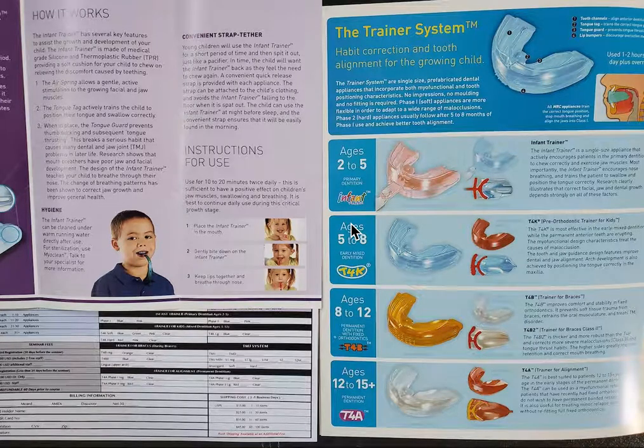And it was StraightSmile Solutions, and today we're going to be talking about Myobrace, MRC, specifically the Myobrace infant trainer system, the Myobrace MRC trainer system in general.